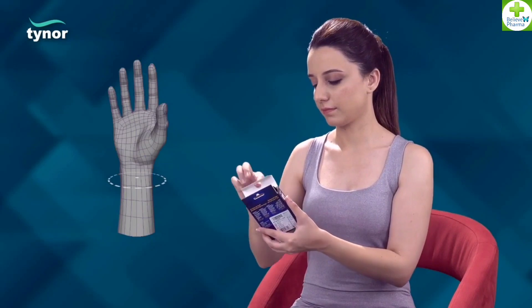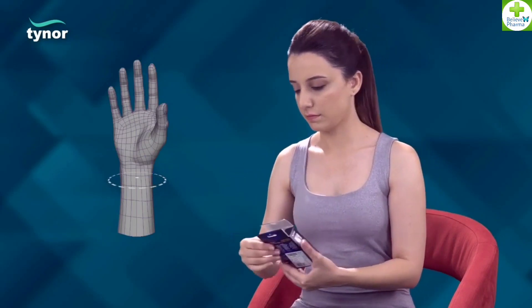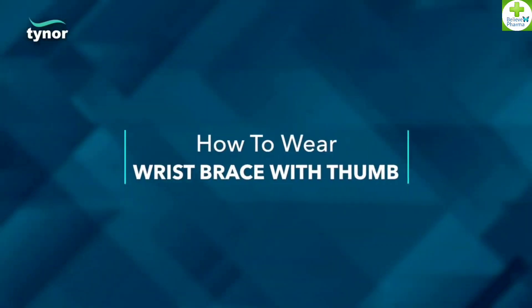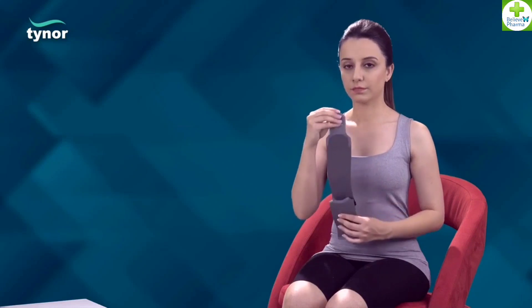Now let us see how to wear the wrist brace with thumb. Disengage the Velcro straps to make the product ready for use. Insert the thumb into the thumb hole provided.